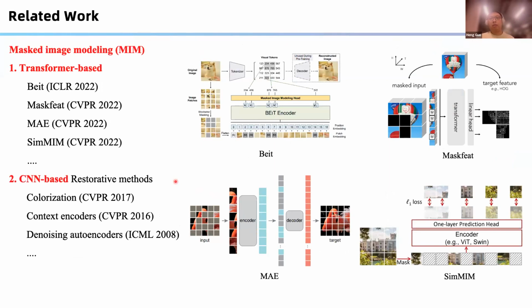In the past year, there has been a surge of research in this area, partially driven by the work named MAE, masked autoencoder, proposed by Kaiming He. In fact, much earlier, there were works using image reconstruction for visual pre-training, although they were known by different names at that time. Today's new methods can be simply classified into two categories: reconstructing the original image or reconstructing the image features.